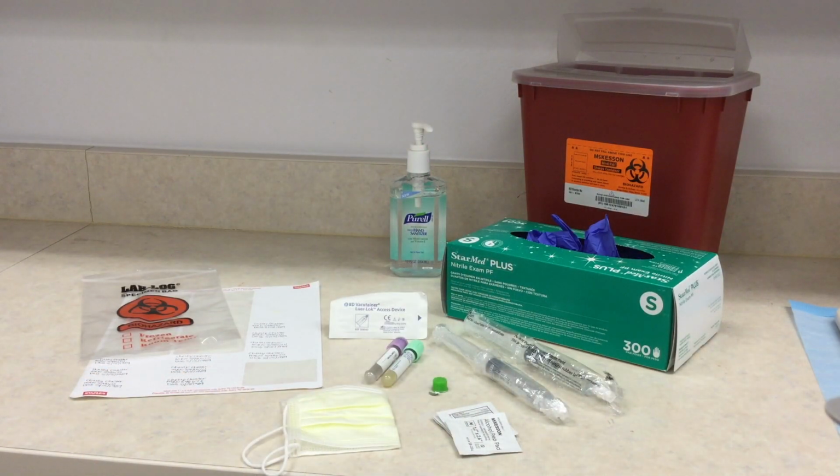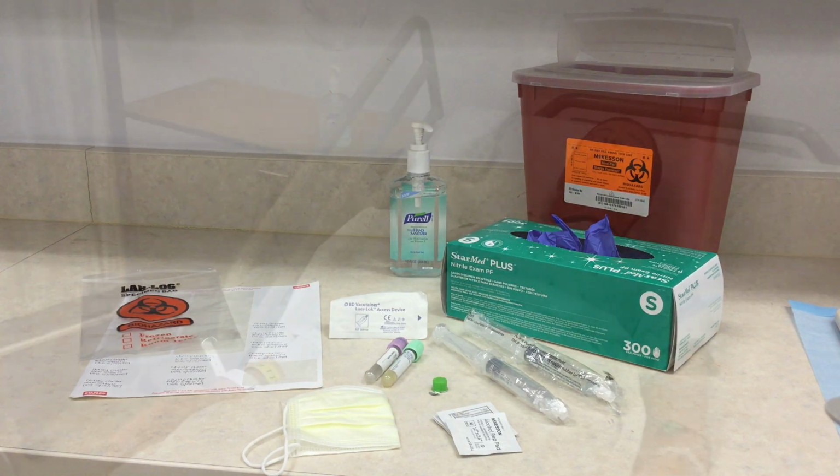Now Kayla will gather up all of her supplies. This includes clean gloves, a mask, alcohol wipes, 2 10 ml normal saline flushes, a vacutainer with appropriate blood specimen tubes. For this patient's labs, the nurse will need a lavender tube for the CBC and a green tube for the BMP and cardiac enzymes. You will also need specimen labels with the correct patient information, a biohazard bag, and a biohazard container. Once you have all of your supplies, you are ready to go into your patient's room.